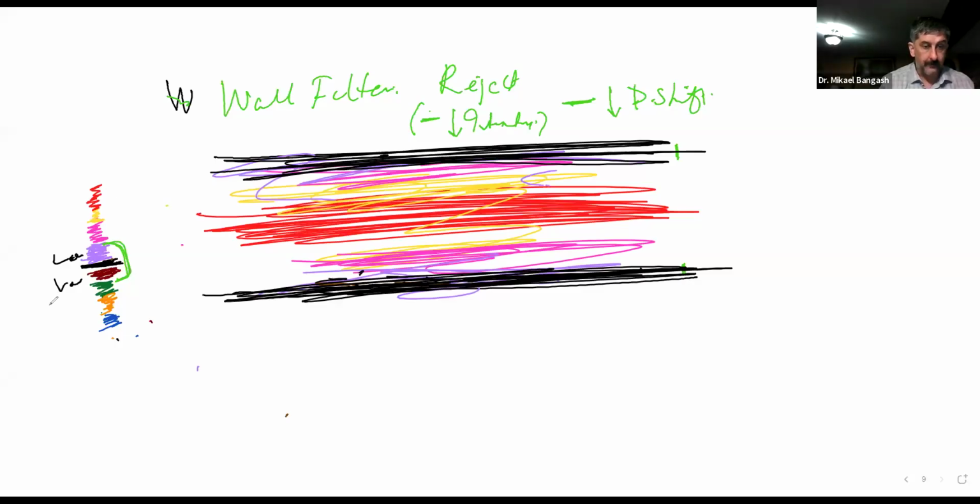Something that you find at the top of your color map, at the extreme poles of your color map. It will not be strong enough to do anything to the very low Doppler shifts. Traditionally, within a blood vessel, where do we mainly see those low velocities?